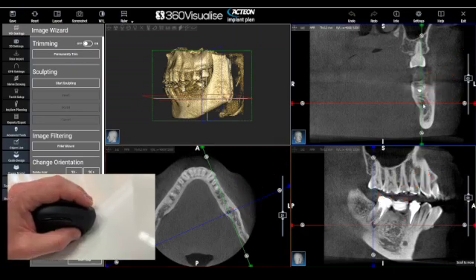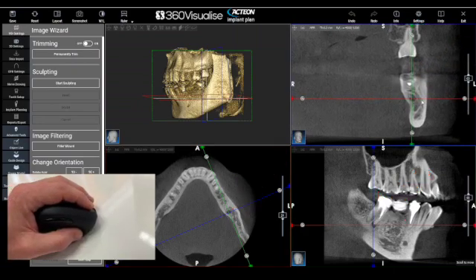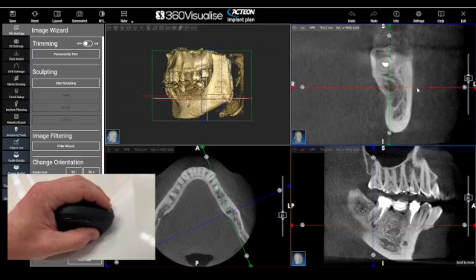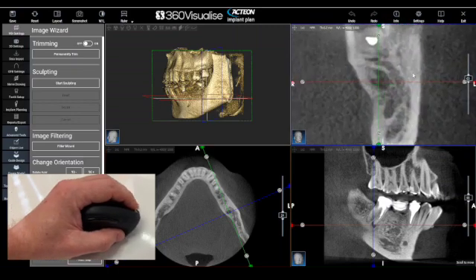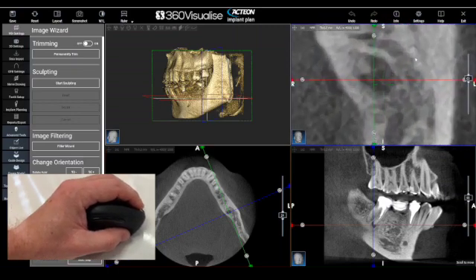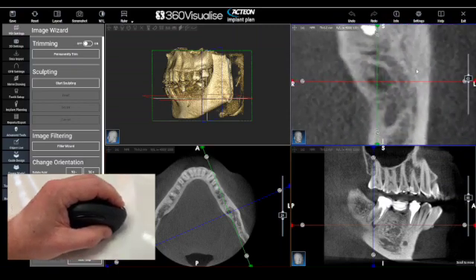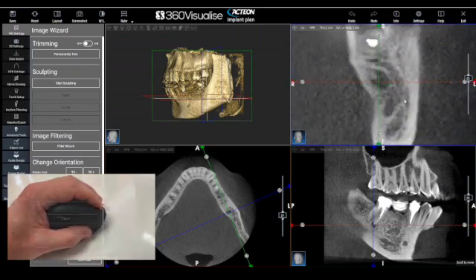We can right click and move the mouse forward to zoom in, and backwards to zoom out.